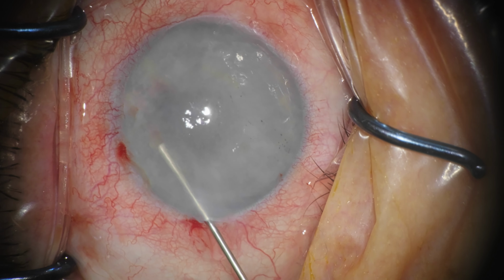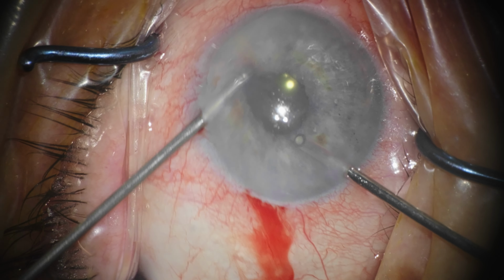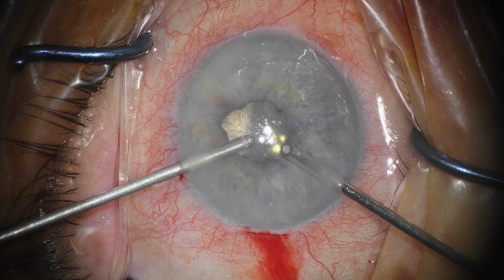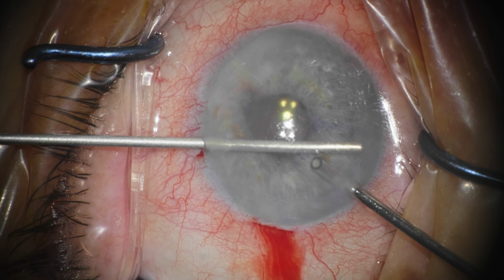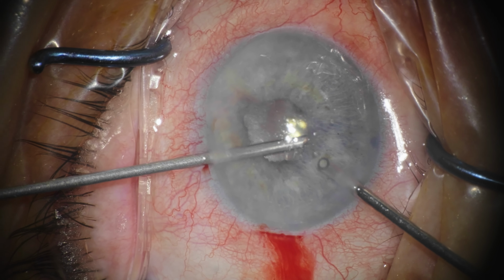We start off by injecting dilute triamcinolone, and then we start the anterior vitrectomy at the 12 o'clock pupil margin, where we can see that the pupil has been peaked for a long time, and the vitrectomy seems to sort that out. We don't want to do a pars plana vitrectomy just yet, and we consider that to be unnecessary at this point.